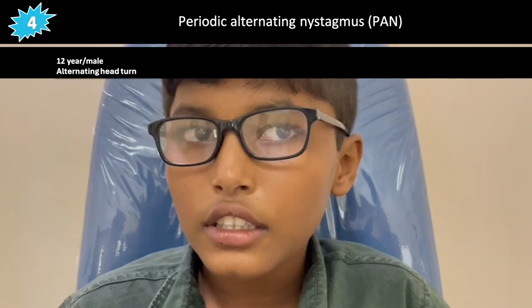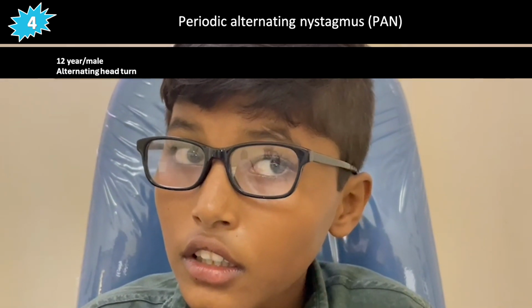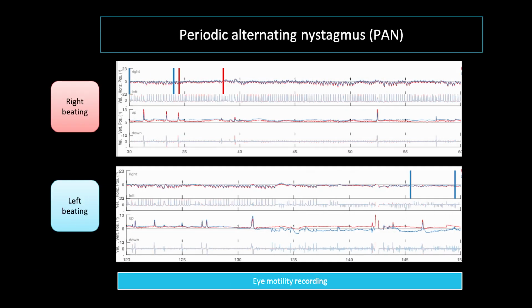This case of 12-year-old male is a very interesting case of alternating AHP and nystagmus since birth, where we suspected it to be periodic alternating nystagmus. And we confirmed it with the help of eye motility recording, where we can see right beating nystagmus changing to left beating after 135 seconds. It is very important to pause and observe all the nystagmus patients for minimum of 3 to 5 minutes to not miss periodic alternating nystagmus. Supramaximal recession of all 4 recti muscles is the surgery of choice in such cases.